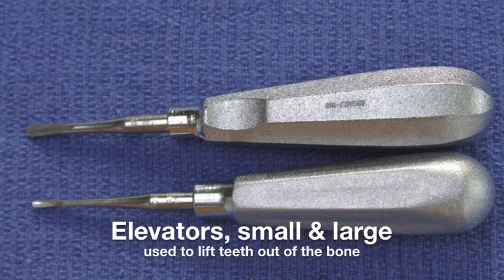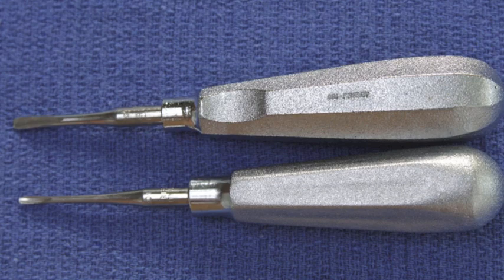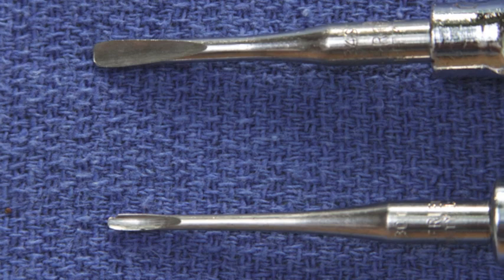These instruments look remarkably like screwdrivers. However, I understand they are not. Their specific design is that to elevate teeth from the socket, and they are called elevators.